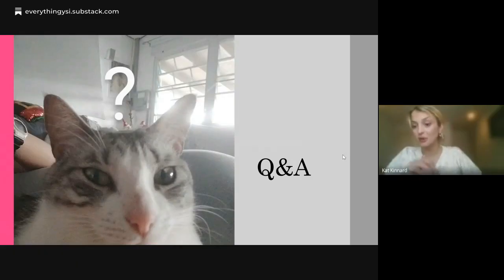However, there is one little loophole, I guess. If a patient were to have a seizure, you put the EEG on, you may see some slowing. It's called post-ictal slowing. And that just means that after a seizure, our brain kind of recovers. Things are slow. You see those delta waves that resemble what we saw in deep sleep or in slow wave sleep. But you're able to see those things. But that's the one little loophole, I guess, to your question. But in all, no, you cannot see if it has occurred or not.